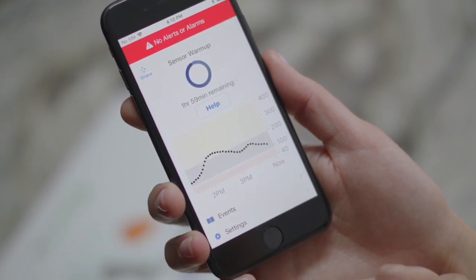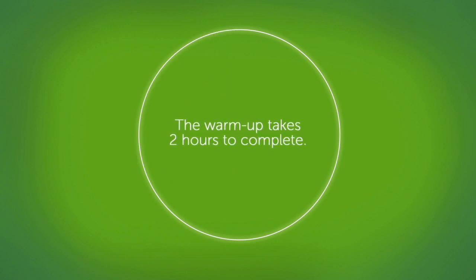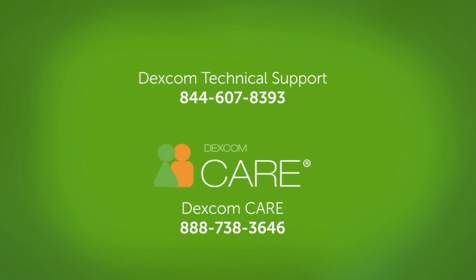Now your sensor warm-up has begun, and the warm-up will take 2 hours to complete. You will start getting your alarms and alerts again after the warm-up is complete. And that's how you replace your transmitter. Of course, if you have any questions, call Dexcom Technical Support or Dexcom Care.